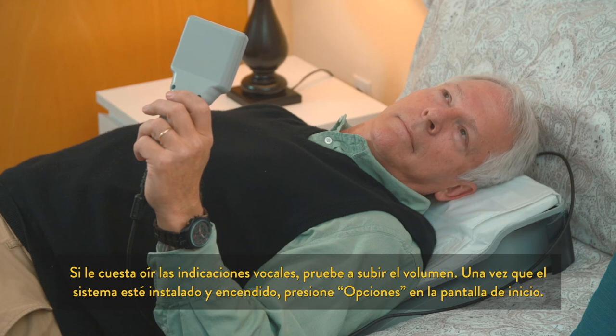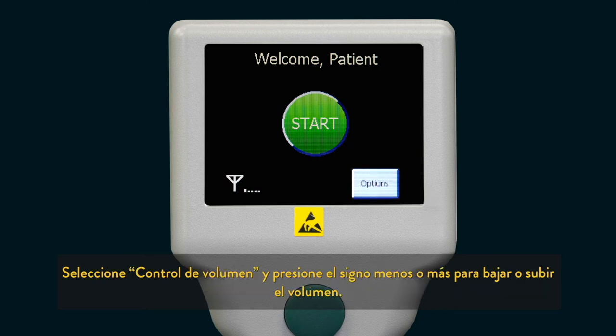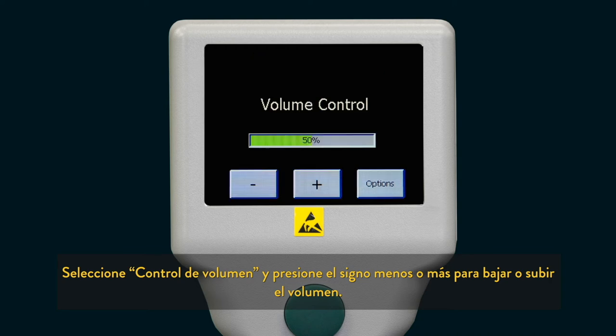If you are having trouble hearing the voice prompts, the volume can be increased. Once your system is set up and powered on, click Options on the start screen. Select Volume and toggle up or down to increase or decrease.